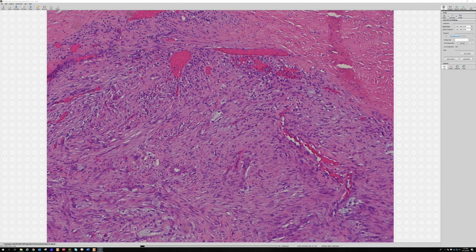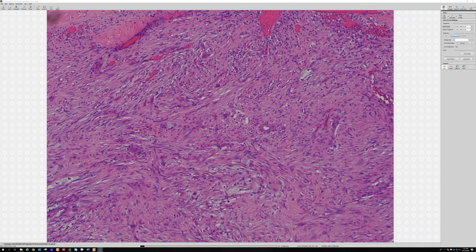The other thing is that nodular fasciitis, even though it looks almost identical to what reactive myofibroblasts look like, say in granulation tissue, it turns out is actually probably a neoplasm because it has a rearrangement. And what genes are rearranged in nodular fasciitis? MYH9 USP6. Yes, MYH9 USP6 fusion has been described, a translocation.